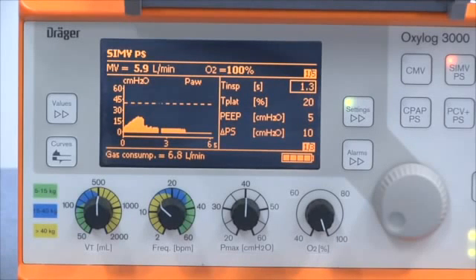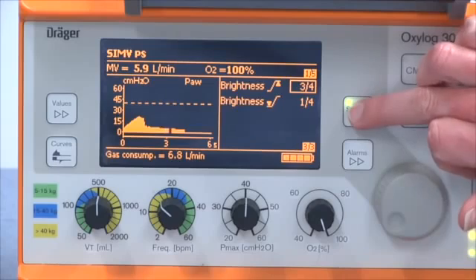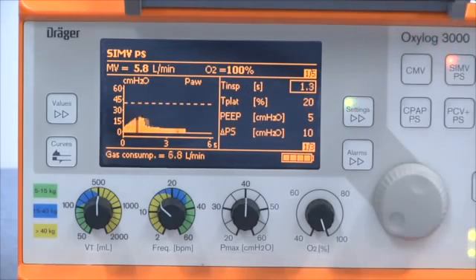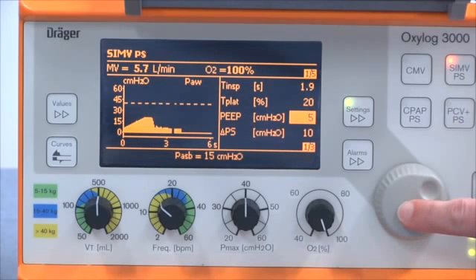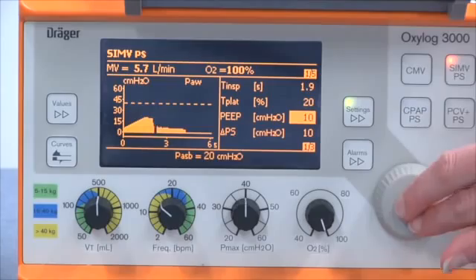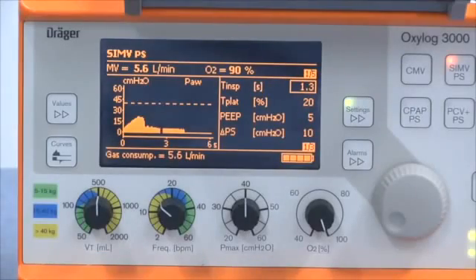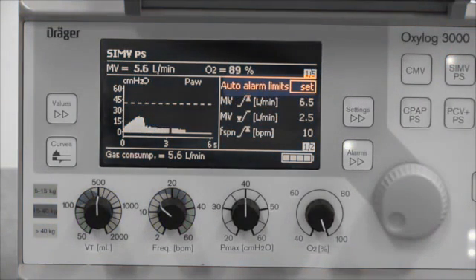Next, adjust supplementary values like PEEP and inspiratory time by going through the settings menu. Go through the settings pages by pressing the settings key, then highlight and select the parameter you want by turning and pressing the rotary knob. When the parameter is selected it's displayed in inverted type. Change its value by turning the rotary knob and then press again to confirm. Finally, once you're happy with the settings, set the alarm limits. A quick way of doing this is by setting auto alarm limits, which automatically sets alarm thresholds around current settings.